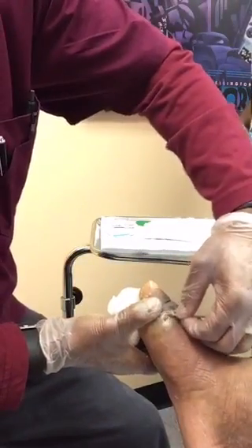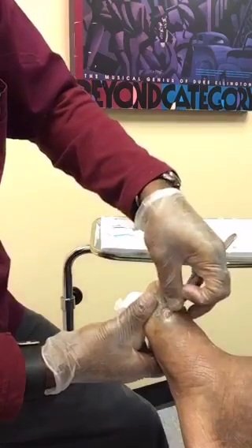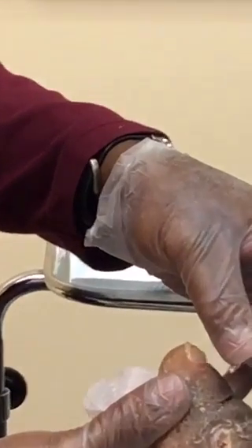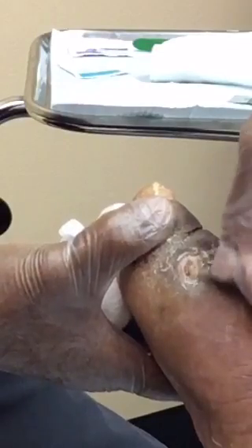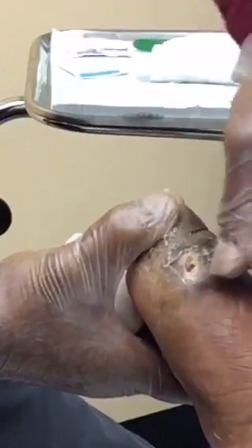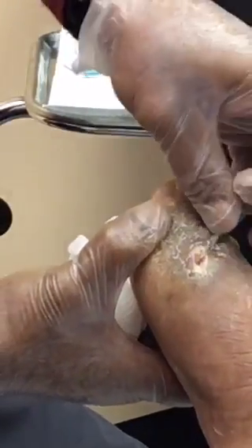I don't know if you can see close enough, but the wound is getting a little more pink around the edges. We're making good progress here. You can see that the rim is now nice and pink, showing good blood flow to the skin.